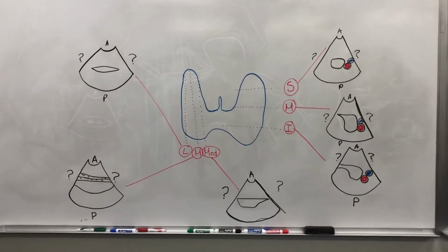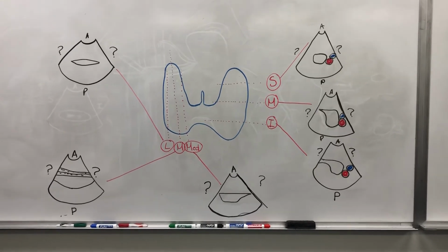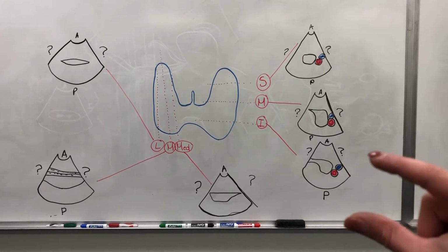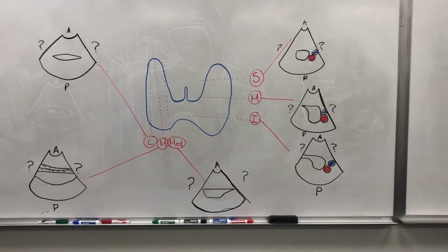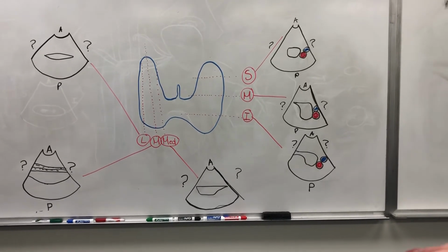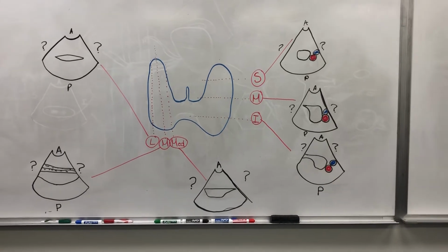Usually if you have a thicker isthmus in your quote-unquote mid-cut, then you're probably a little too inferior. So again, you move down inferiorly and you'll have this nice thick cut of the isthmus, and usually the thyroid becomes a little shorter, a little more like a blunted, short fat little piece, versus here where it's a little bit longer, anterior to posteriorly, and a little bit thinner, more of a square, where here it's very, very short and squatty.